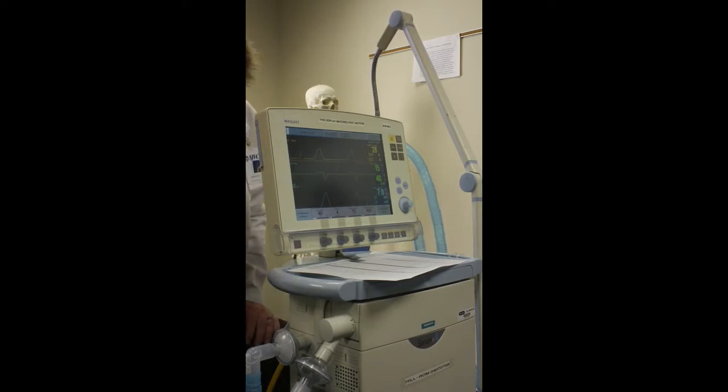I'm saying patient's oxygenation. Maybe, but ventilation. Remember, ventilation is our tidal volume and our rate. Tidal volume is a direct measurement of the volume that we delivered to the patient, the amount of air that was actually delivered to the patient.